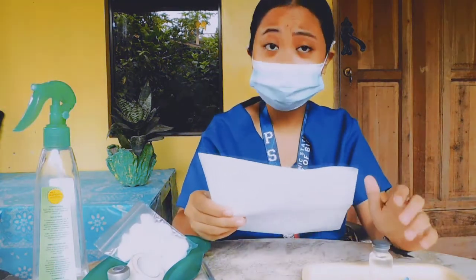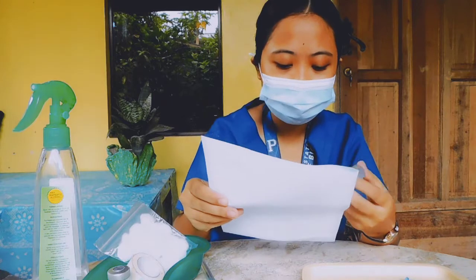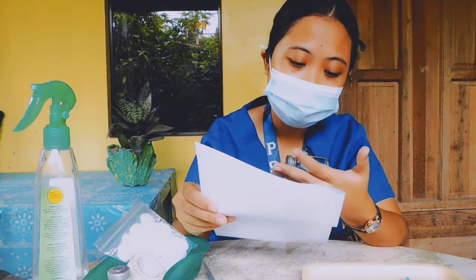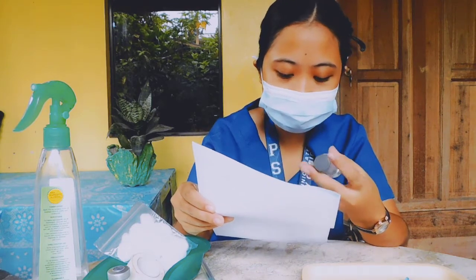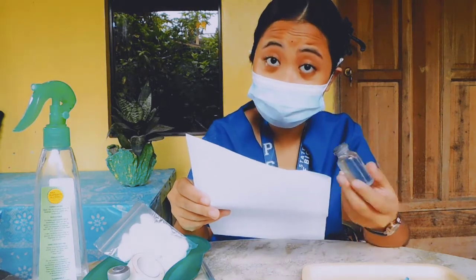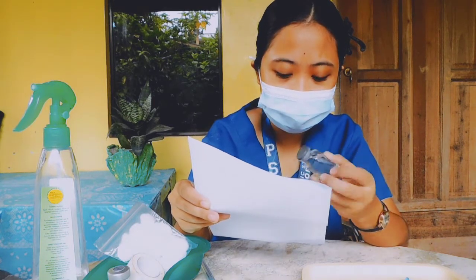We need to check the label of the medication carefully against the MAR to make sure that the correct medication is being prepared, and then follow the 3 checks: the manufacture date, the dosage, and also the expiration date. Then read the label on the medication before withdrawing and after withdrawing the medication, and also confirm that the dose is correct.